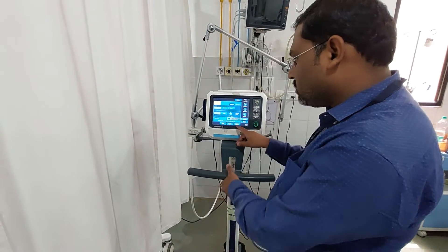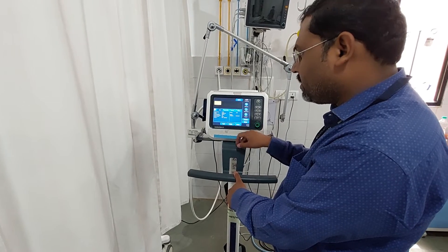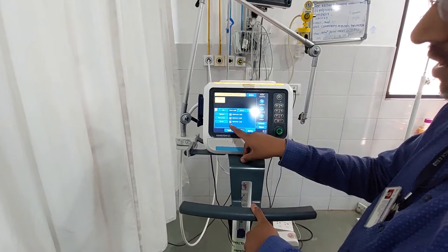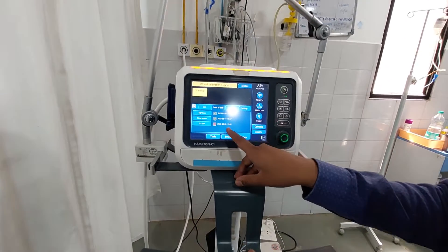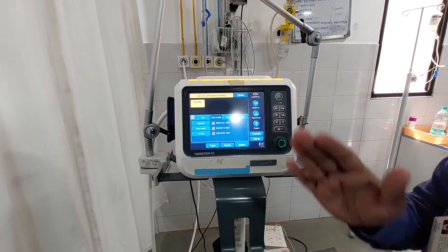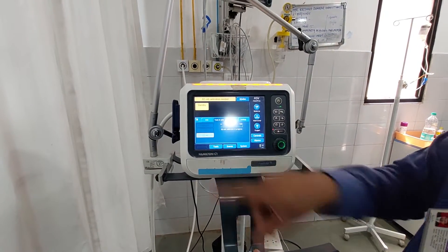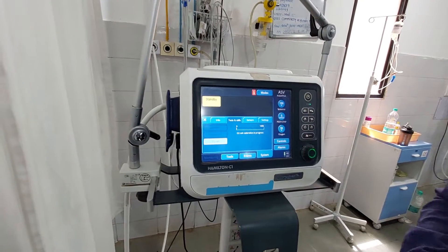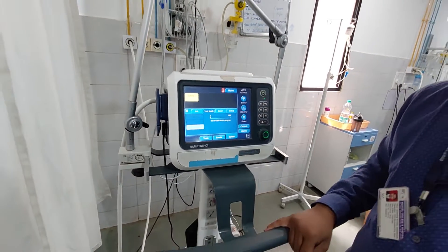Now in the system menu you can observe there is 'Test and Calibration.' Under that there is O2 cell — it shows a cross, meaning it is not working. Now that we have replaced the O2 cell, we have to perform the O2 cell calibration. Press on this — O2 cell calibration is now in progress.